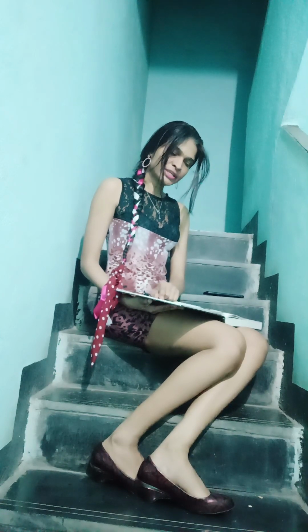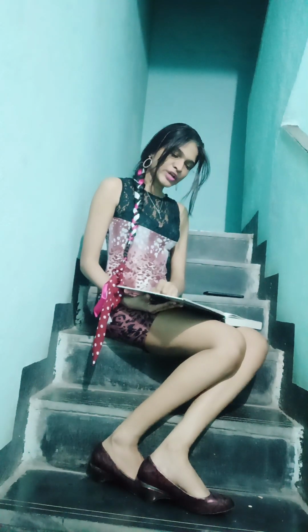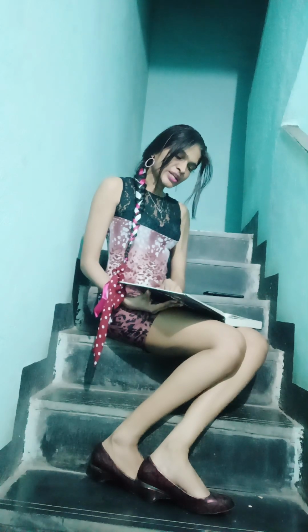A major advantage of direct gonioscopy, especially with the infant Koeppe lenses, is its use in sedated or anesthetized patients, as in the examination of children. These lenses are also useful in examining the fundus through a small pupil with a direct ophthalmoscope. In indirect gonioscopy, the slit lamp may provide better optics and lighting, which could be an advantage when looking for subtle details in the angle. Furthermore, the method requires fewer additional instruments and occupies less space than direct gonioscopy does. Indirect gonioscopy is also performed faster than direct gonioscopy.